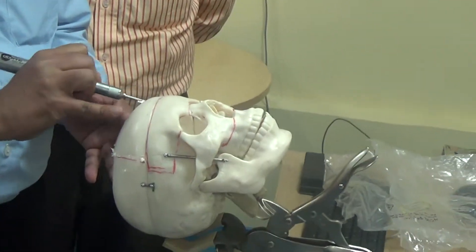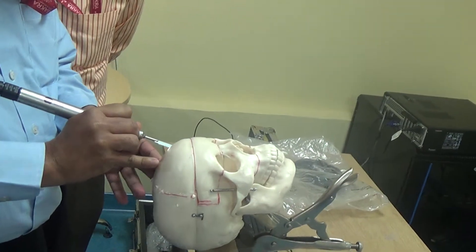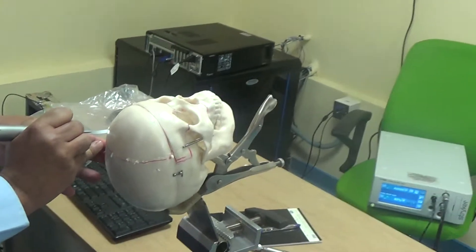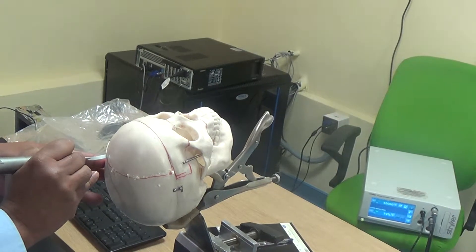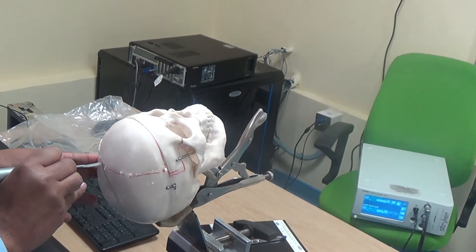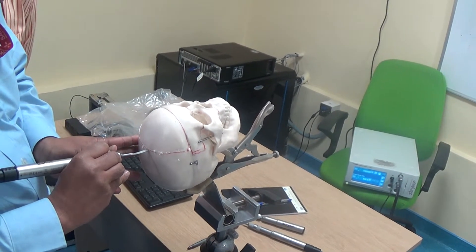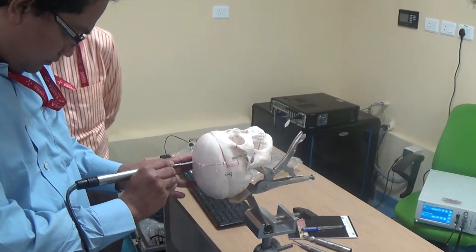Just follow that line and follow that, then call me for the next one. Okay, let's do the right front of the screen so you can go over here. First you do this.